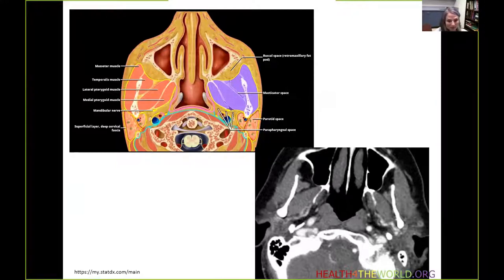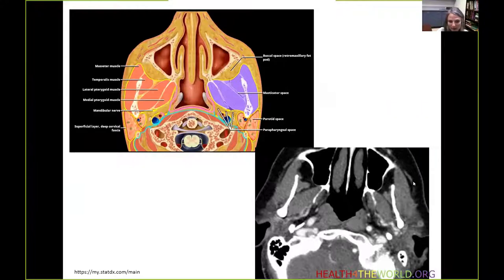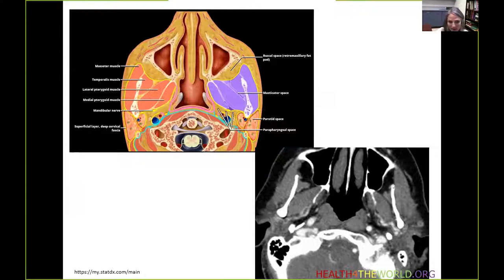On the axial CT at the level of the nasopharynx, we can see the muscles of mastication including the medial and lateral pterygoid muscles, the temporalis muscle, and the masseter muscle, as well as the parts of the mandible.